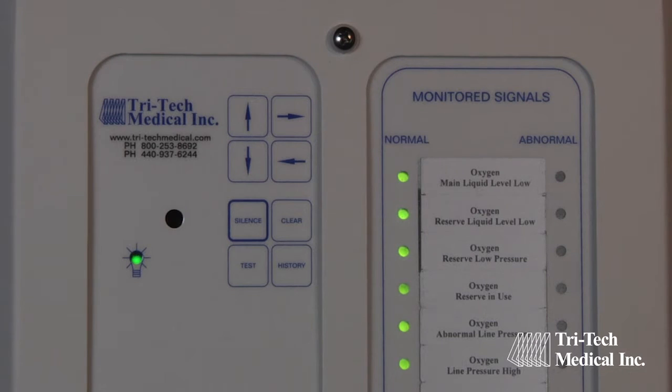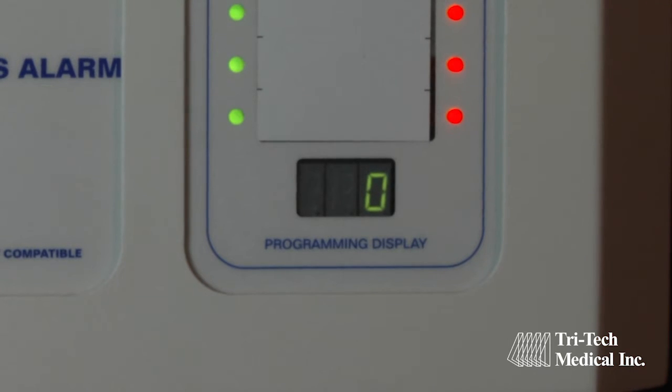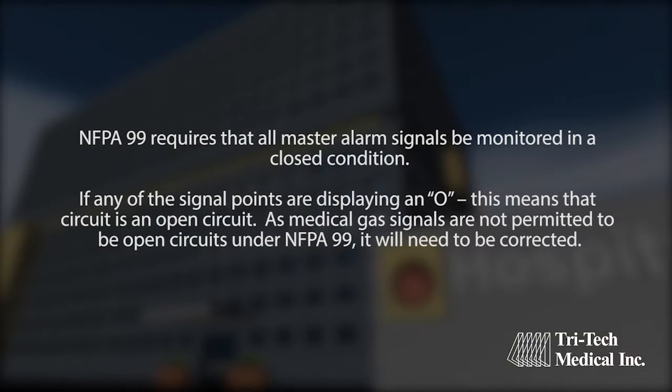The top signal point LED should be blinking on and off. Also, the LED display at the bottom of the board should be displaying either a C or an O. The C or O is the result of a continuity test of the circuit connected to this alarm signal point. With all source equipment operational and providing gas pressures in the normal operational pressure ranges and the circuit wired correctly, the master alarm should display a C or closed condition for each alarm signal point.